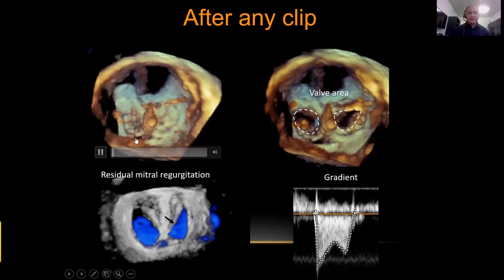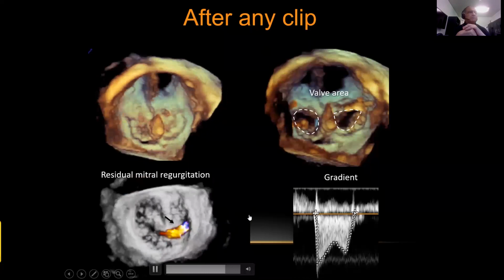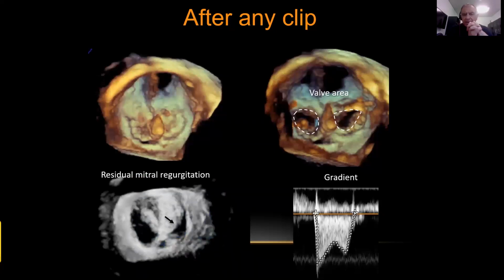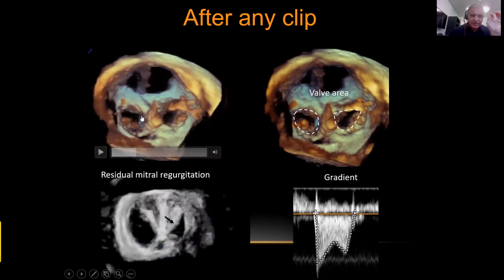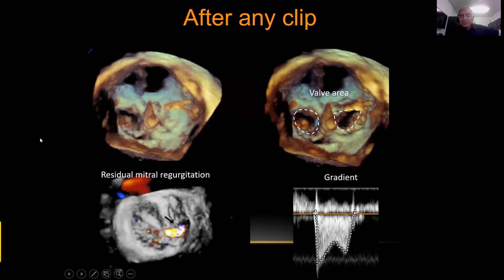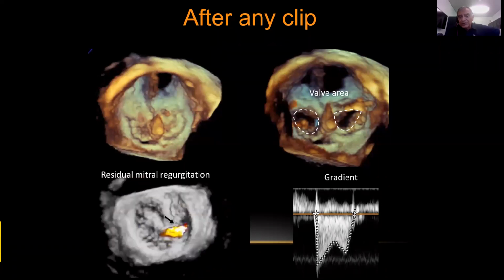And then after any clip, what we do is measure the valve area, the residual regurgitation and the gradient. There is some debate about how you can measure the valve area. To be honest with you, in my opinion this is the best method, because with 3D echo from the left ventricular perspective you see exactly the margin of the leaflets, and then you can use this margin to measure with 3D echo. Are we precise? There is no gold standard for that. We are the gold standard. So this has to be precise.